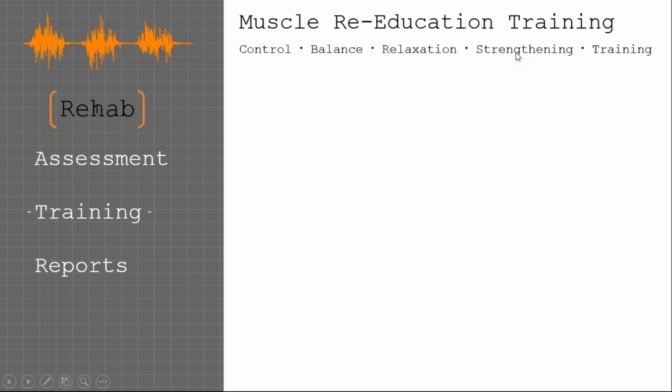So in terms of intended use from our side, we call it muscle re-education. It's muscle control, so how much muscle tone there is, say, at rest, and how much can they control the tension levels. Muscle balance, we can look at it from an agonist-antagonist relationship, or from a left-right balance. We can compare healthy, non-healthy, that type of thing. Again, we get into multiple channels.